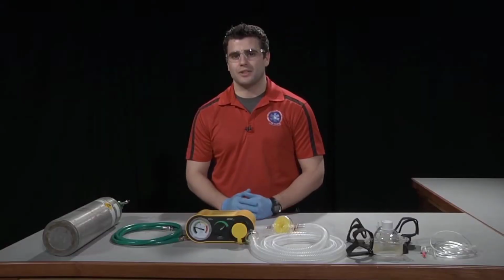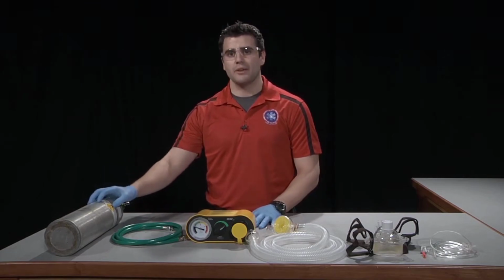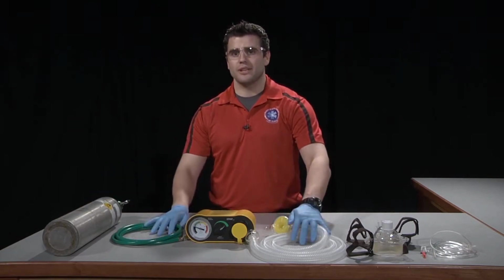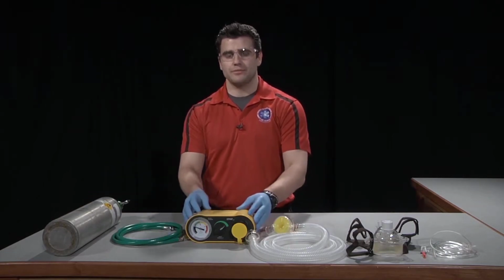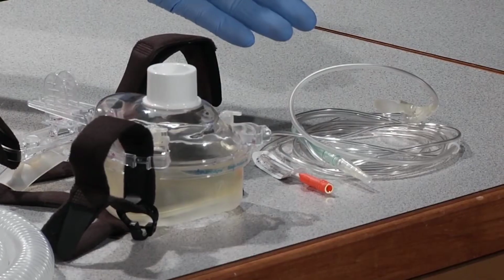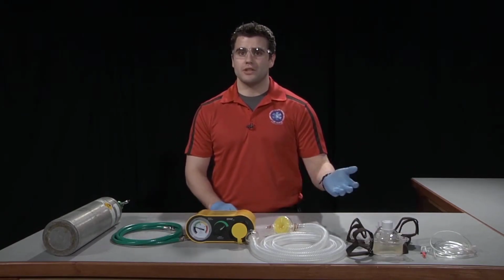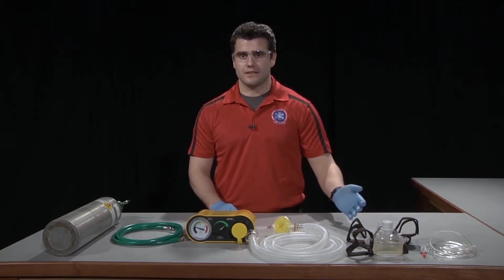Now we're going to gather and assemble our equipment for CPAP. The equipment that we'll need is an O2 supply, hoses and tubing, a CPAP machine, our CPAP mask with head straps, and our ETCO2 nasal cannula. From there, we're going to coach our patient on how to use the CPAP mask.